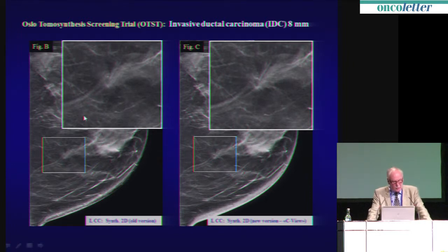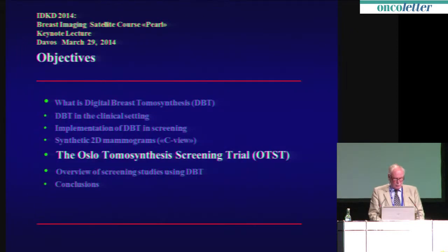The same in this case. To the left, I show you the old version. Here you can see the new version. The fine spiculations are much better seen. So it is to be expected that there will be an ongoing improvement of these projection images, also these synthetic views.